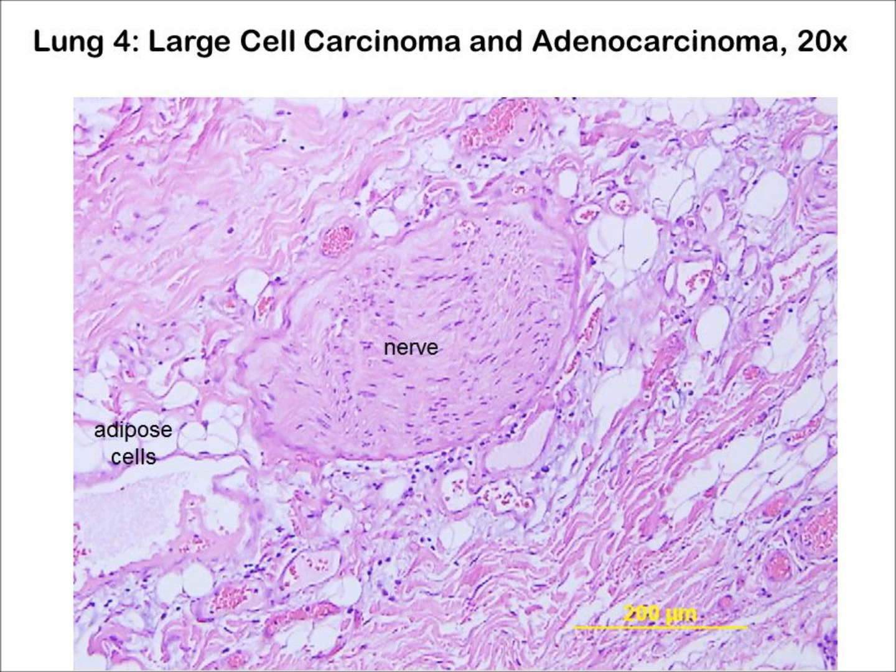Now move the field of view to the lower right-hand side of the cartilage, assuming that the slide is in the same orientation as shown before. Locate the nerve tissue that is within the adipose tissue. Note that it is encapsulated and has a wavy appearance. In some places, you can see axons passing through a myelin sheath. The myelin sheath itself has a crackly appearance.